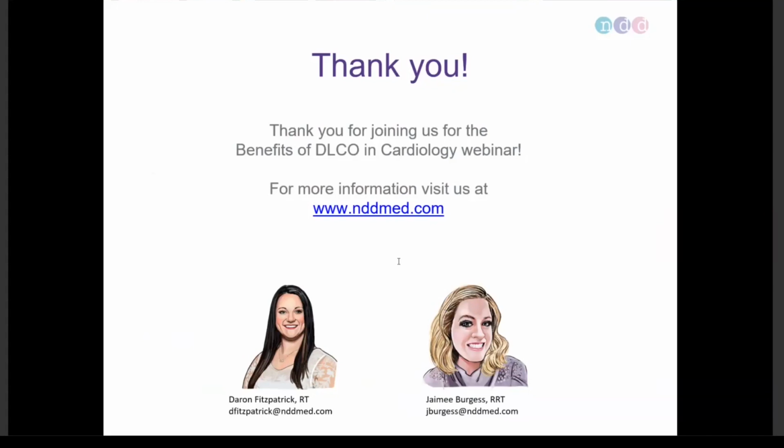What I've seen, since we do periodically reevaluate, is that most of the time the DLCO is the first thing to change, and we have discontinued the medication for people who had persistent changes over time, where it wasn't just a fluke. It was an actual decrease in DLCO. I don't think I have seen any of the other features related to lung volumes or spirometry with amiodarone, because generally these are very late findings. So I would imagine most of us would stop the medication at the first onset of suggestive symptoms, especially if there was a drop in DLCO from the baseline.